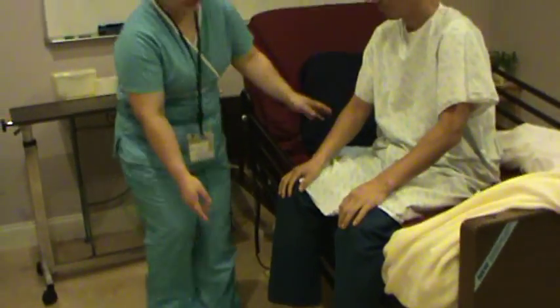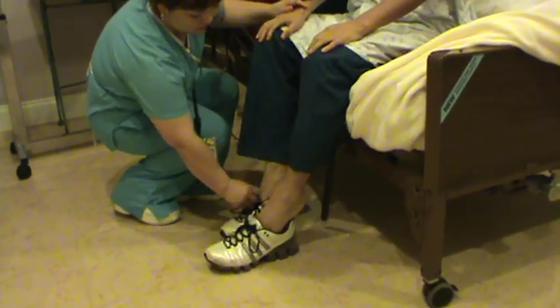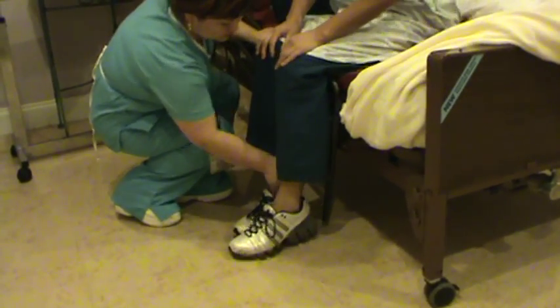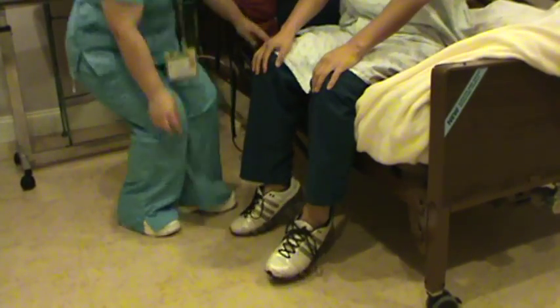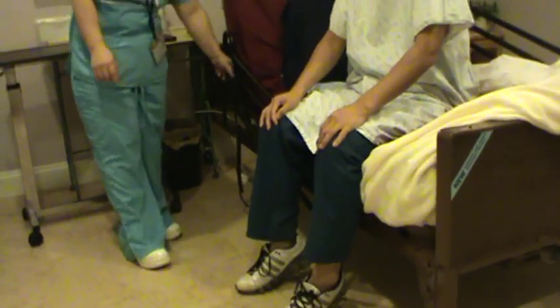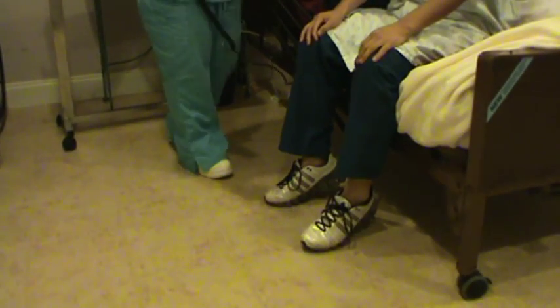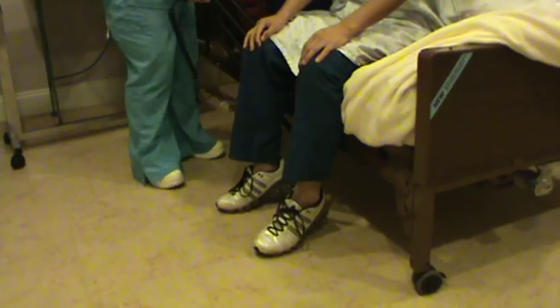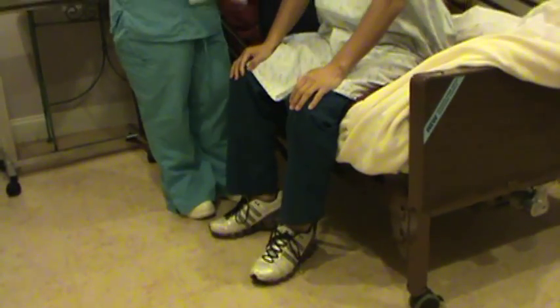Since his foot is not touching the floor, can you wear your shoes? Okay, and still his foot is not touching the floor. Let's lower the bed. Can you scoot a little bit to the front? Just a little bit. Very good. So now he's here.